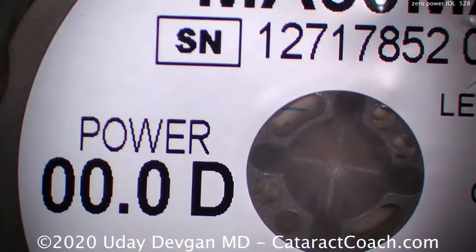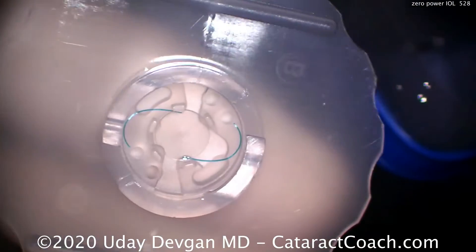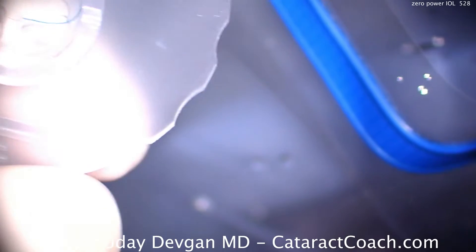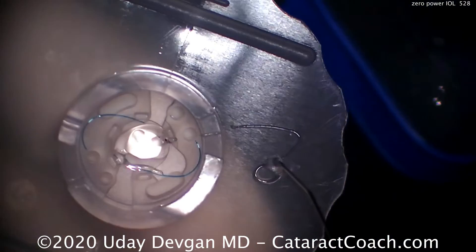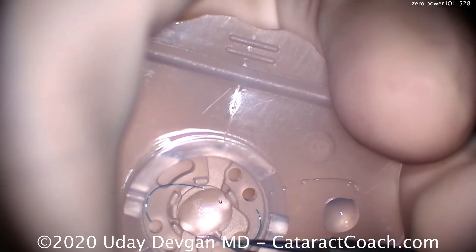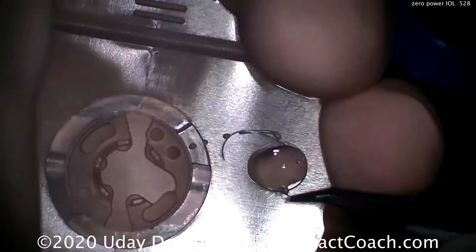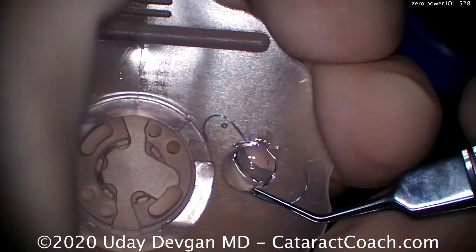And now it's time to load up the lens. There's the lens — zero power. So even though it has no optical power, it's important to implant an IOL. The reason is it acts as a barrier between the anterior segment of the eye and the vitreous cavity in the posterior segment. Here we put a little bit of viscoelastic on top of the IOL, pick it up with our forceps, and grab that haptic very gently. Now we have both sides of the IOL coated in viscoelastic, which is going to be very helpful for lubrication.